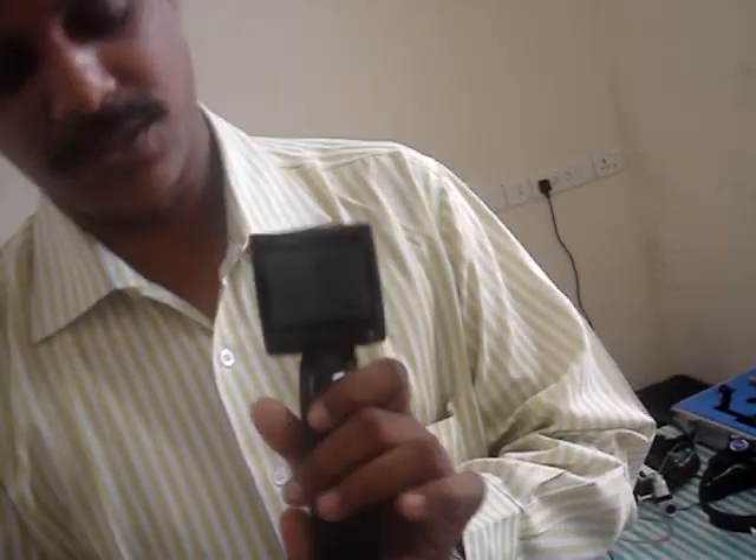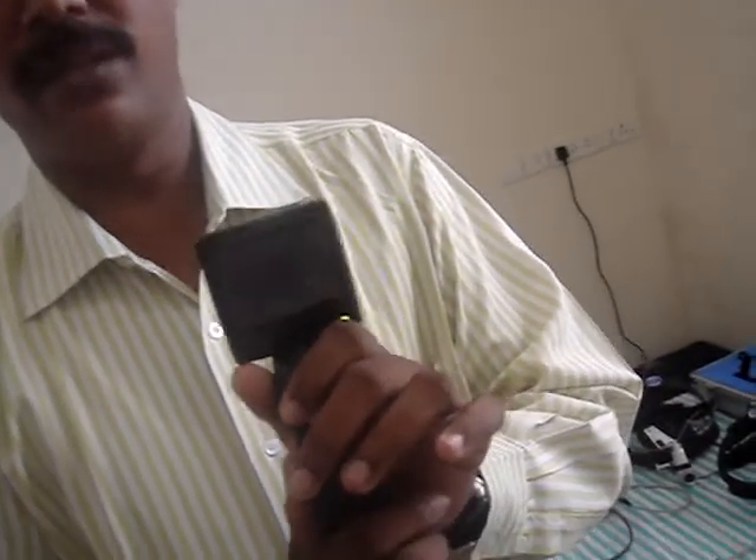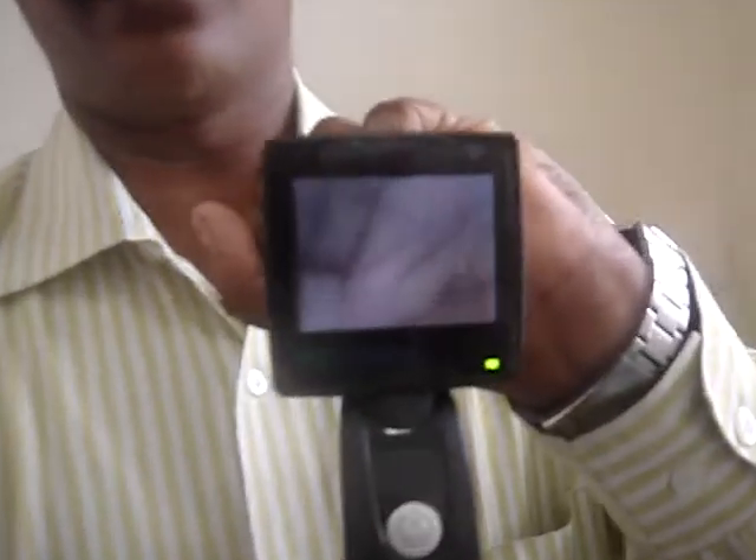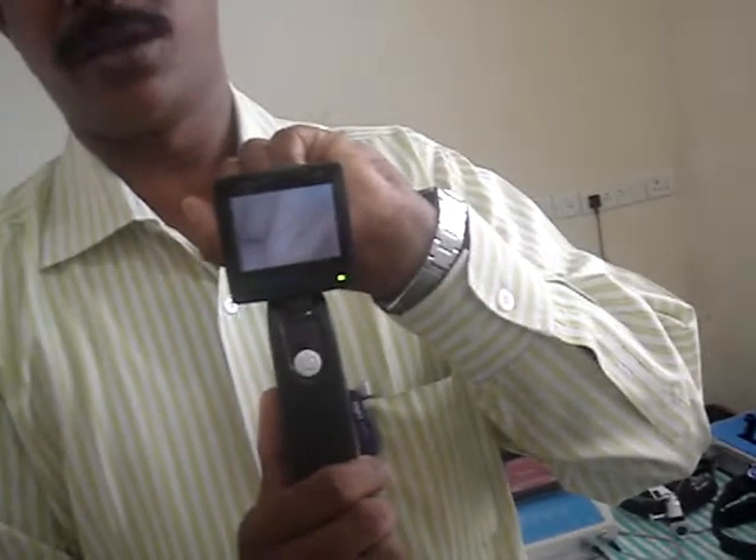Can you switch it on? Yes sir. So that the surgeon can easily examine the otology work, with the camera and the monitor over here, and handle the otology camera.